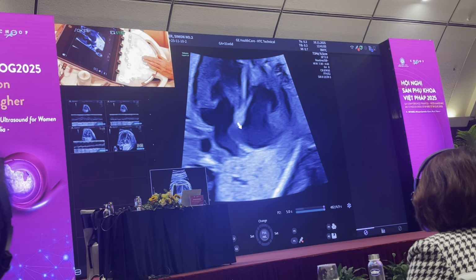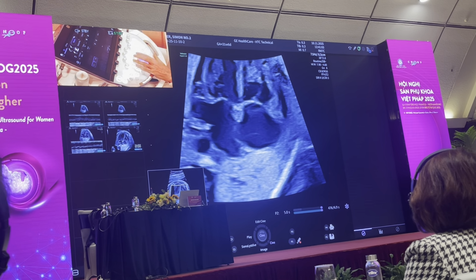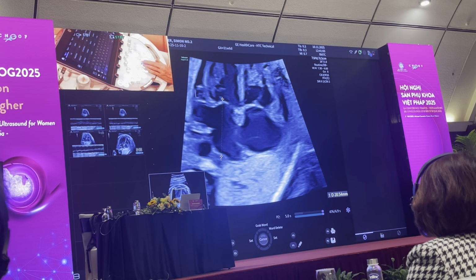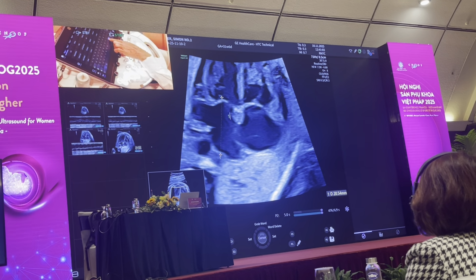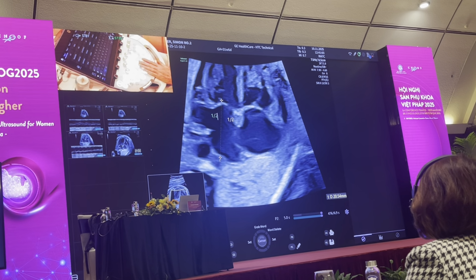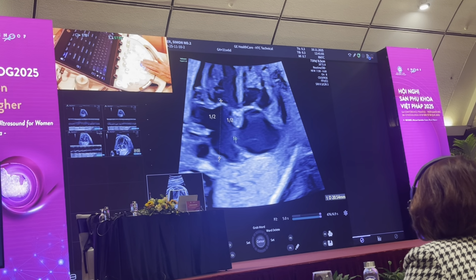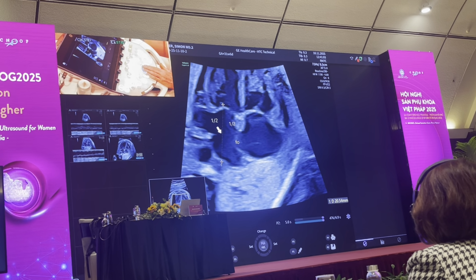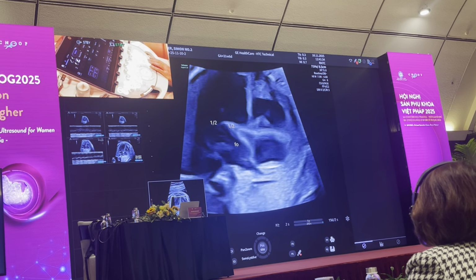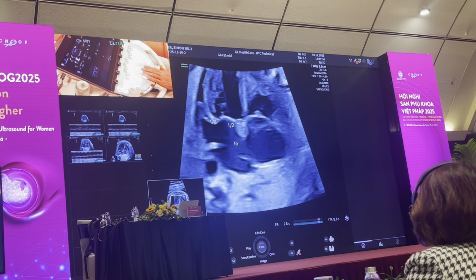The primum, the secundum, and the ovale, and you can see if we rewind that, the ovale should be less than 50% across. So if we take that this is 50% here, this is a half, and this is a half on the opposite side, then the position of the baby's foramen ovale here is normal. It doesn't go across. In some babies, you find that the foramen ovale balloons more than 50% across, and we call it foramen ovale aneurysm.